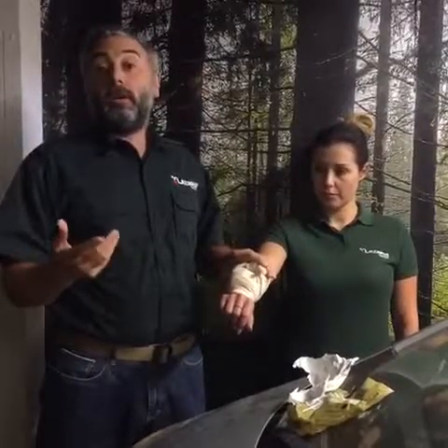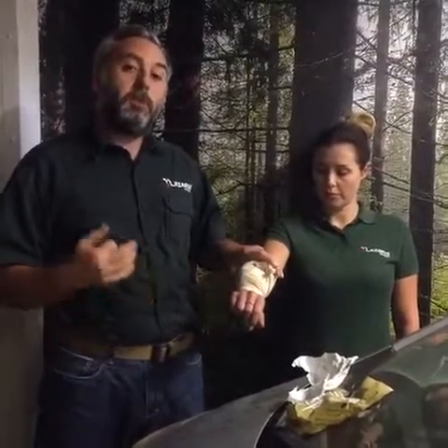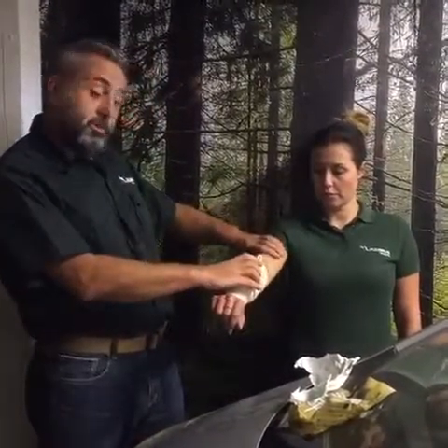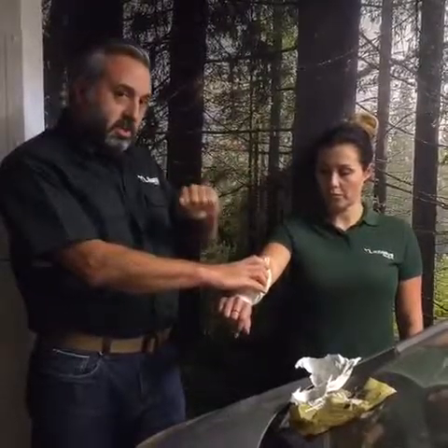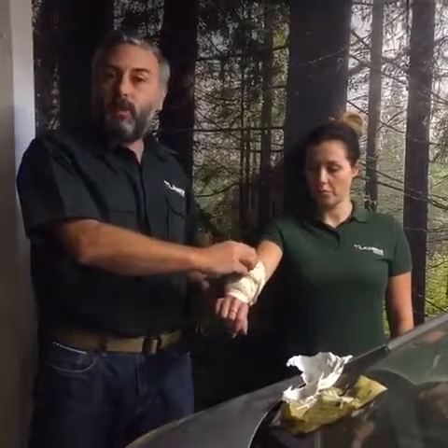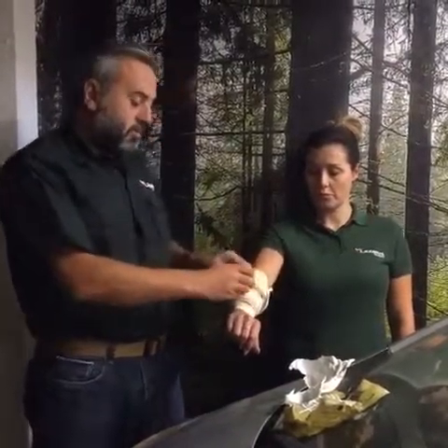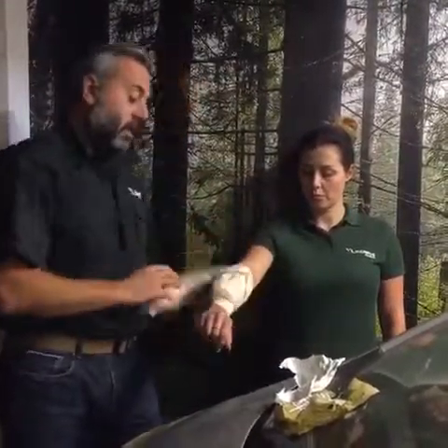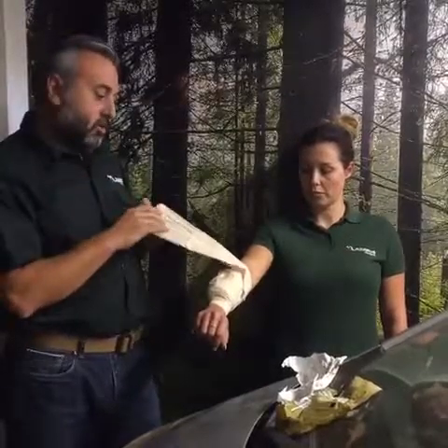Those of you who have done our law enforcement courses, our charity courses for people working in remote hostile areas, or media courses will have noticed that the structure of this is very similar to what we teach in those courses called a tourniquet. In fact, if you apply this upstream of the wound, you can — if done really tight — essentially turn it into an improvised tourniquet. But at this point, we're just trying to make it a windlass dressing to put a firm amount of pressure onto the wound — perhaps where somebody's already applied a towel and the bleeding's coming through.